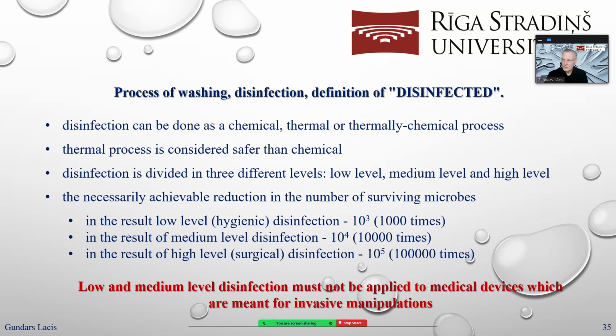For example, immersing. The same as with the water, because of liquid surface tension, air bubbles are fixed on the surface. But here there is no movement. And where is air? No contact with the active agent, no disinfection. If we are spraying on, yes, if we are looking at the surface with the naked eye, we see everything is covered, everything is nice. But to be sure, we have to look in a microscope. And then we will see an absolutely different picture.